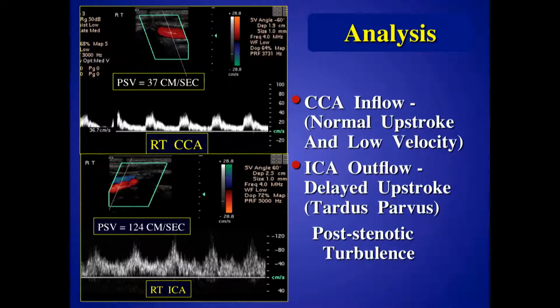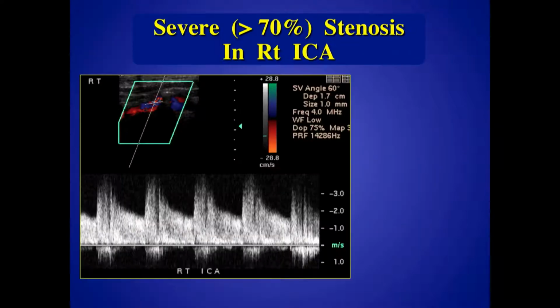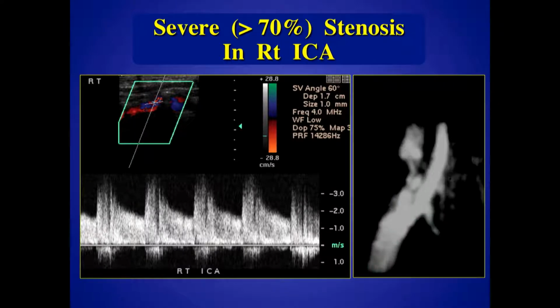You can go back in the room, either yourself or you can send your sonographer if you see the case before the patient's gone and say, you know what, take a closer look. And the way you can do that is sort of by scanning around the plaque, right? You can go from anterior all the way to posterior, seeing if you can see into the vessel. And by doing so here, we actually get a window where the velocity is over 300 centimeters per second. I don't even think we're in the tightest part of the lesion here because it's still a shaggy looking waveform with a bidirectional signal indicating we're probably a little post-stenotic, but at least now you know you've confirmed it's a high-grade stenosis, and it went on to MR to show exactly where the lesion is behind the calcified plaque.